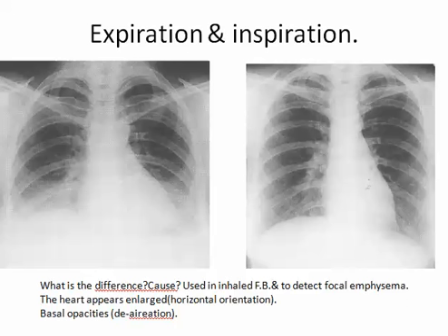When the patient inspires, the healthy part will get inflated, while the part obstructed by the foreign body will become less so, and the reverse. In expiration, the healthy part will be less aerated, while the emphysematous part will still be emphysematous.